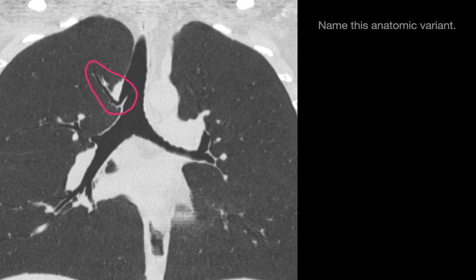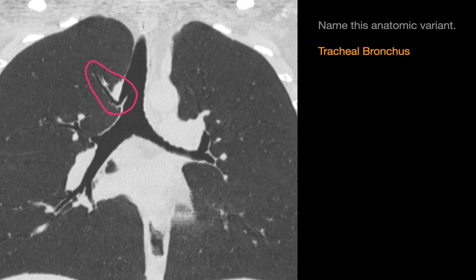The anatomic variant is circled in magenta here. It's an airway that supplies the right upper lobe. In this particular case, there's also a normal right upper lobe bronchus coming off of the superior margin of the right main stem bronchus, which the yellow arrow is pointing to. The anatomic variant is a tracheal bronchus.